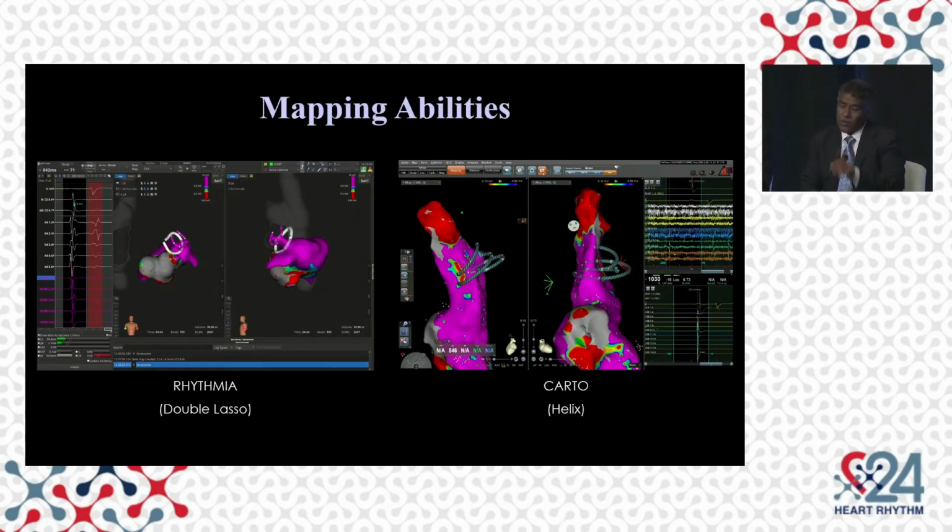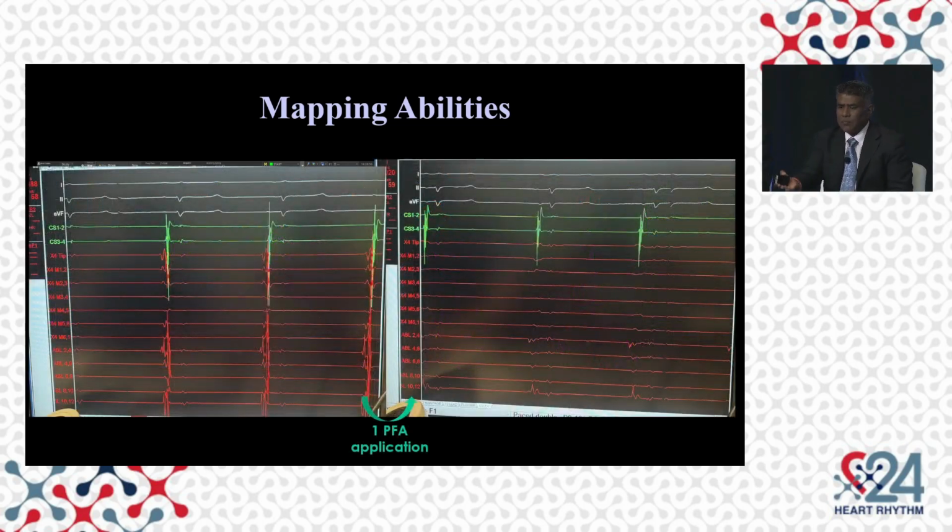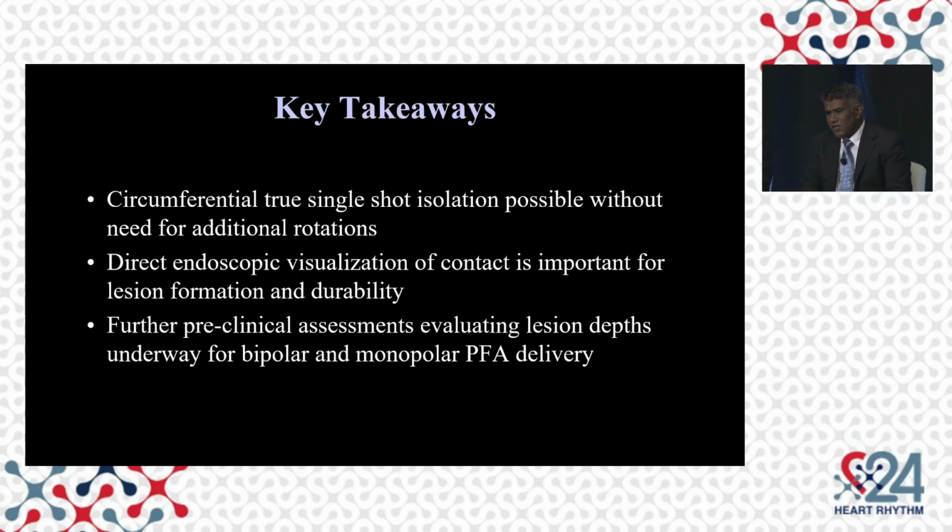In summary, by the way, these are examples of mapping systems showing you that these electrodes can be projected on anything that does impedance-based mapping and give you localization if you wanted to use it as a PFA tool with another mapping system. These are examples of tracings from the electrodes that give you diagnostic feedback. Remember, this is PFA, so everything generally tends to look good, so you really need to rely on contact.